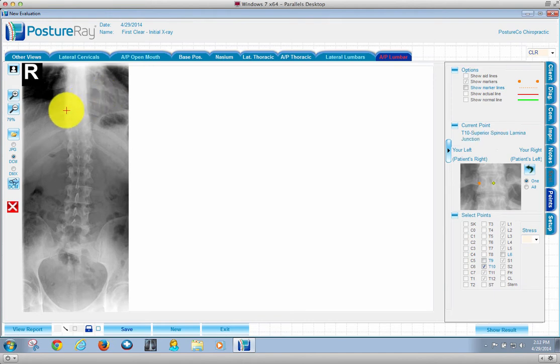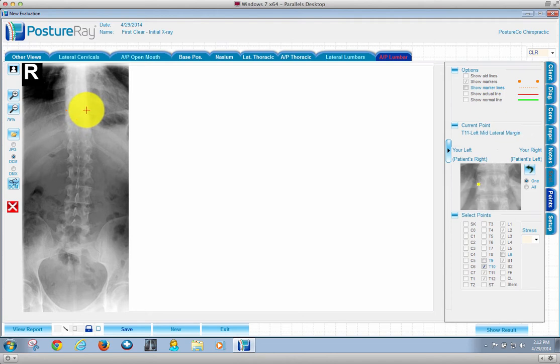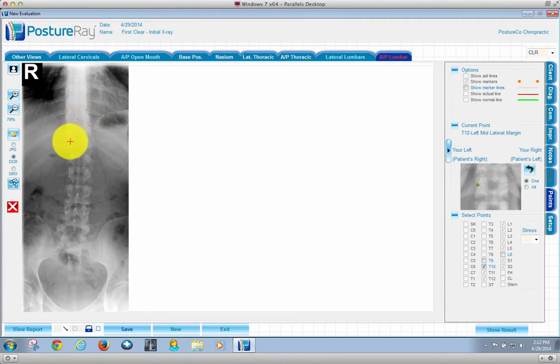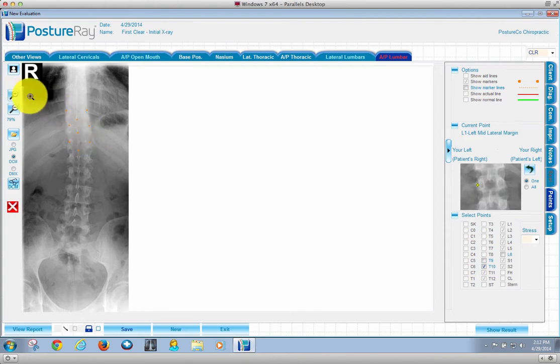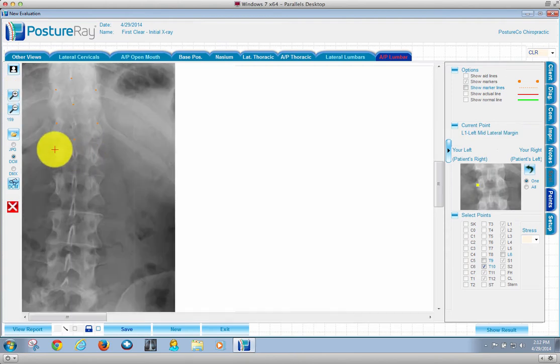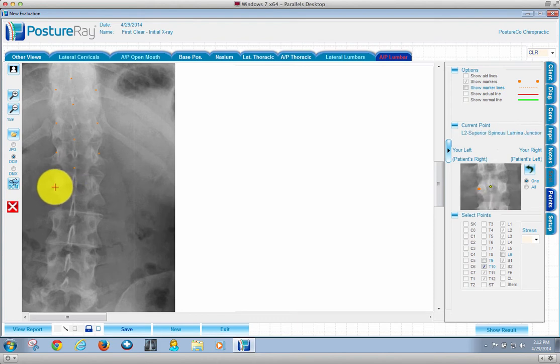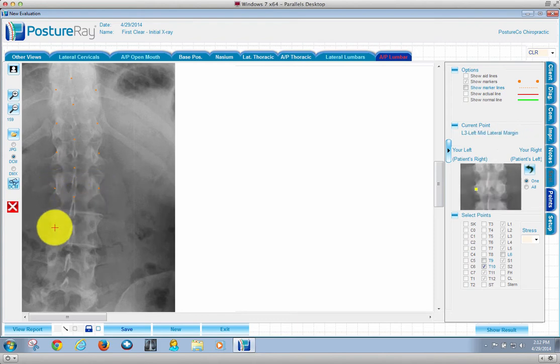So we're going to go ahead. I'm going to hit the lateral body margin, and we're going to do the tip of the spinous. Remember, it projects low on AP lumbar. And then let's blow this up a little bit. And it's this simple.